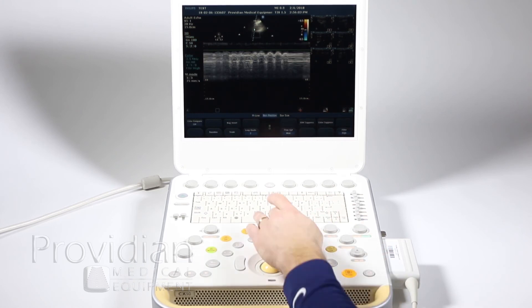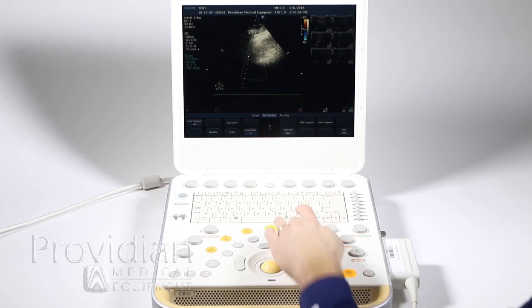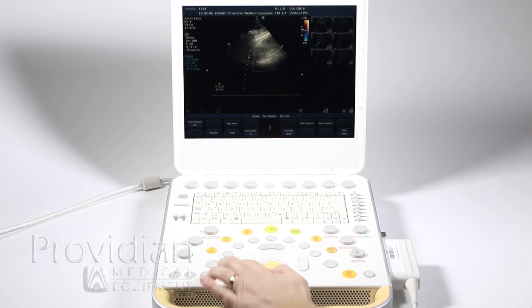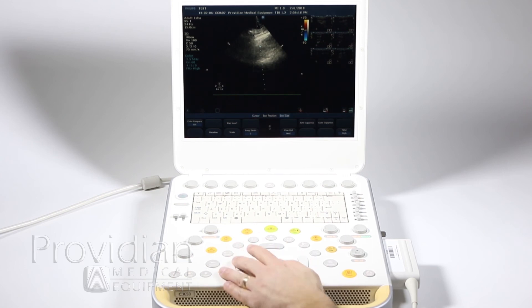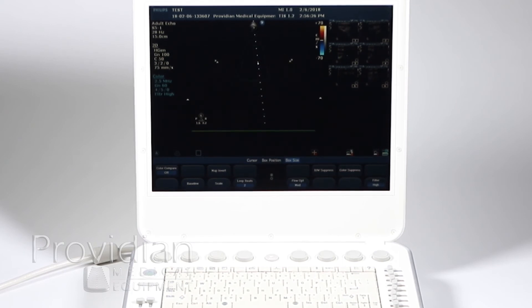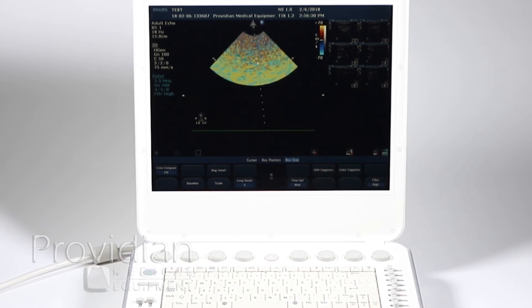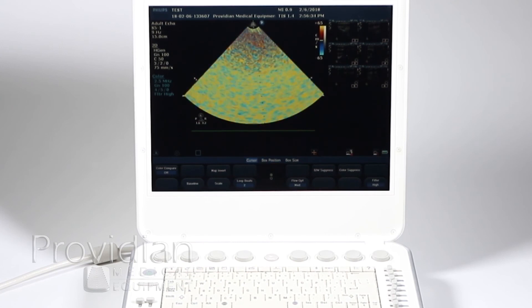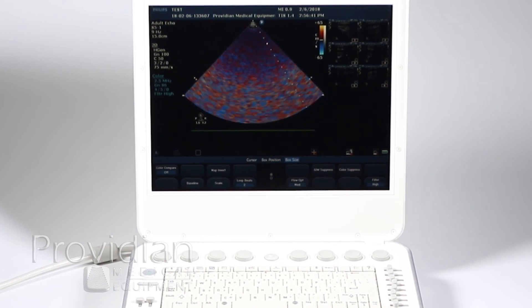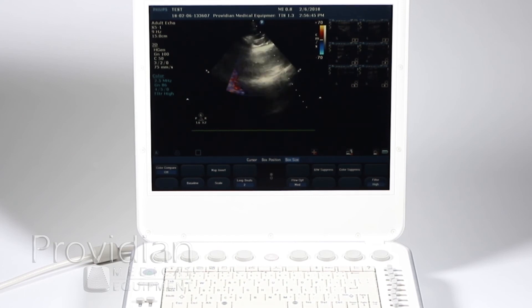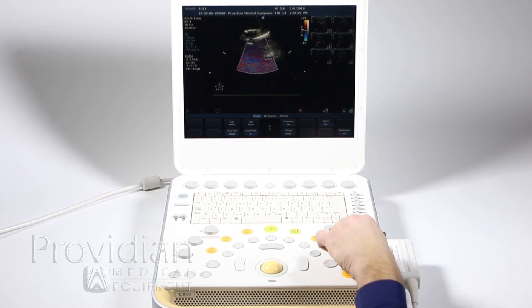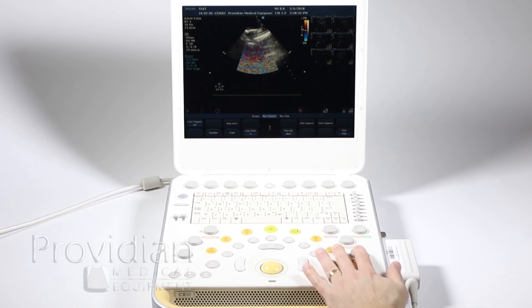For color, just hit the color button. Let's go back to 2D first, then hit color and we'll get our color box. This cheat sheet for the trackball tells you whether you want to change the box position or get the Doppler cursor and change the box size. Let me turn up that color gain so you can see it better. Now I'm changing the box size, the position, and moving the Doppler cursor. We have our active mode for gain — we can change the 2D gain or the color gain by pressing the active mode to choose between those two.